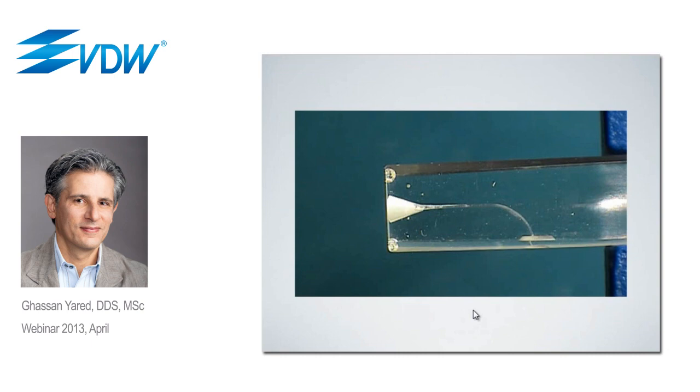I'm going to show you here a video that shows that binding does not happen, and that torsional fatigue is in a way eliminated. You will see here a reciproc instrument being used in this canal in one shot. So no irrigation, no patency. It will go from the coronal orifice to the apex in one shot. And this explains that binding does not happen and that torsional fatigue resulting from the cutting will not happen, as you will understand.